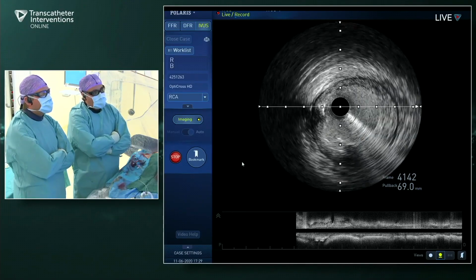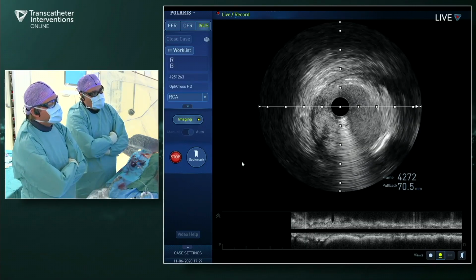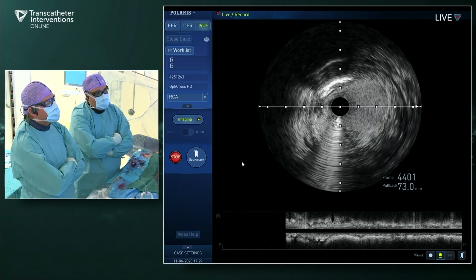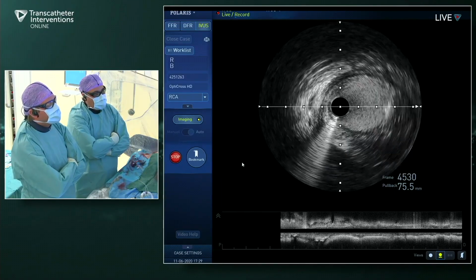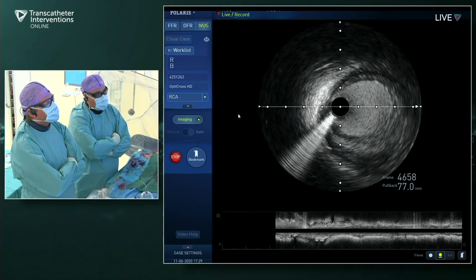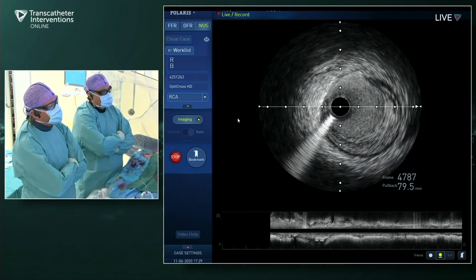6, 4 to 6 before, but now against the. You know, sometimes you like it, sometimes you don't. If it's super calcified, sometimes the true lumen is not great because then you have to do atherectomy. But in this case, it's not circumferential, and it yielded after the initial balloon. So this should be able to expand with conventional balloons and then stent.